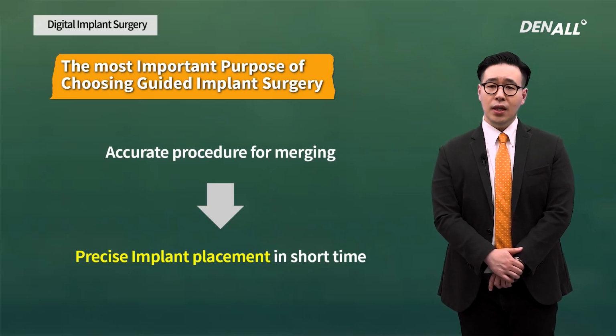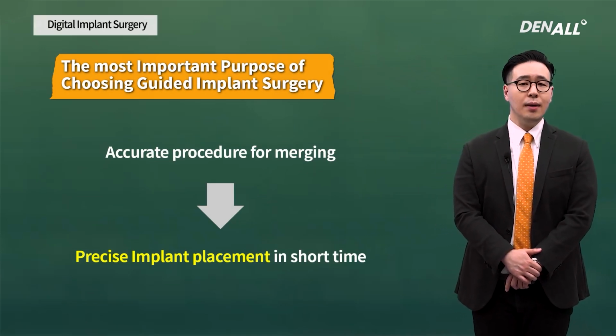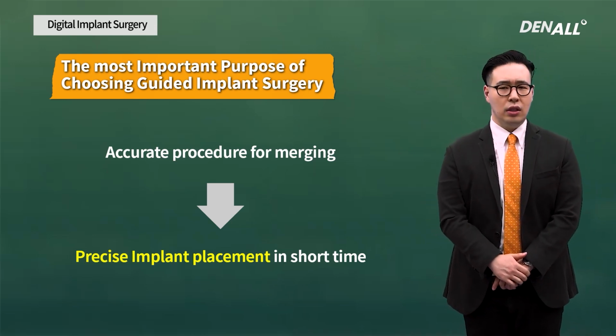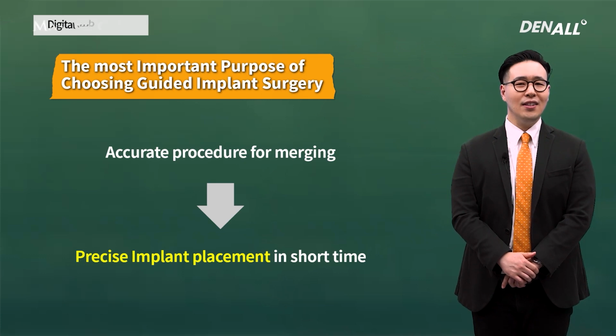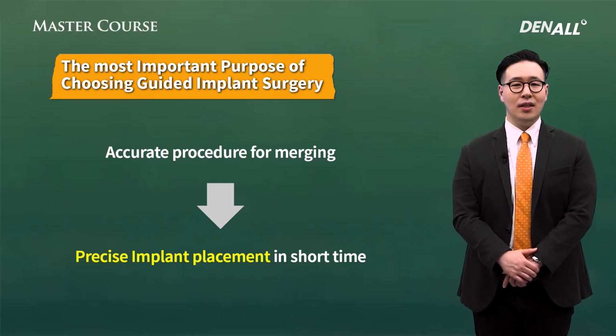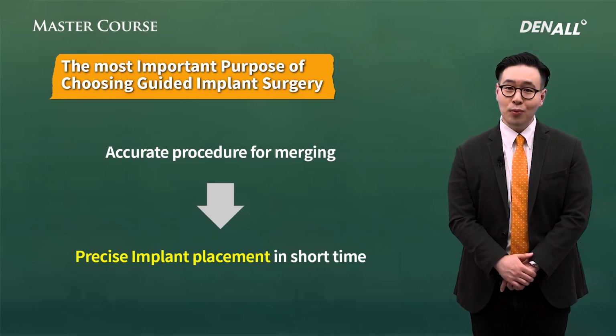Like this, both aesthetics and long-term survival of an implant should be satisfied for anterior implant surgery. For anterior implant surgery, I prefer to use digital one-guide surgery. Most importantly, the data should not have distortions.